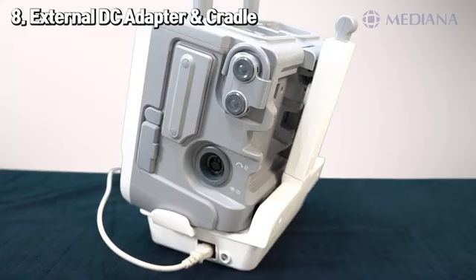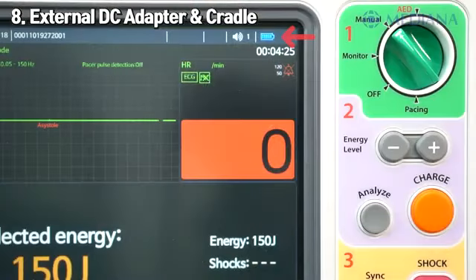The external DC power source can be a big help when transporting a patient to the hospital in an emergency case. Even though the dual batteries provide 5 hours of operating time each, there can be a case when you don't have enough power and you may need to recharge the battery. Putting the device together, you can verify that the DC power input icon appears on the screen. Battery charging status is shown on the front panel of the device.